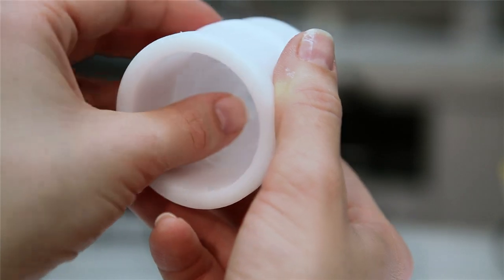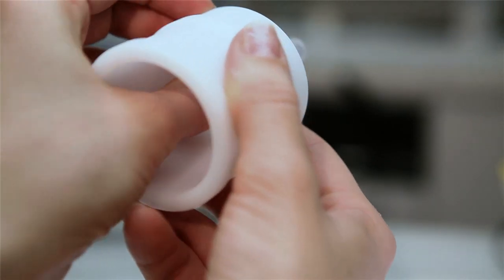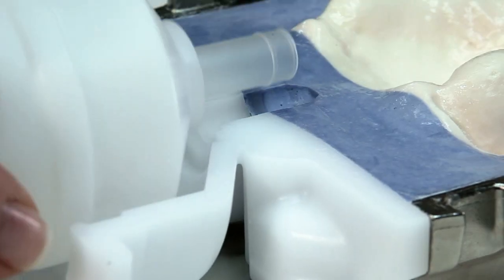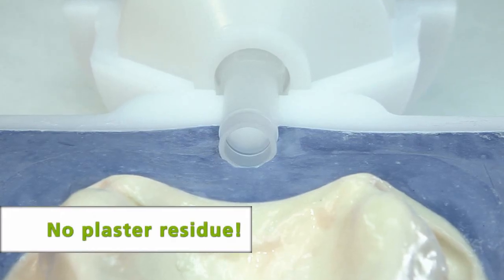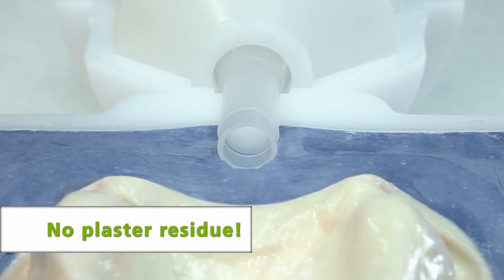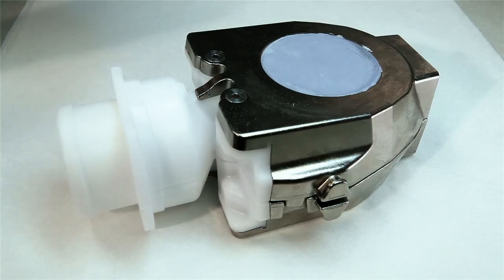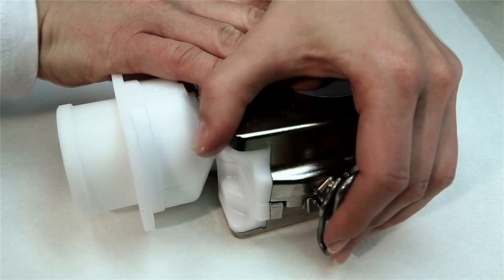Press the IvoBase funnel into the centering insert until it stops and place it in the lower flask half. Make sure that no plaster residue remains in the injection area. Now lock the two flask halves with the locking clasps.